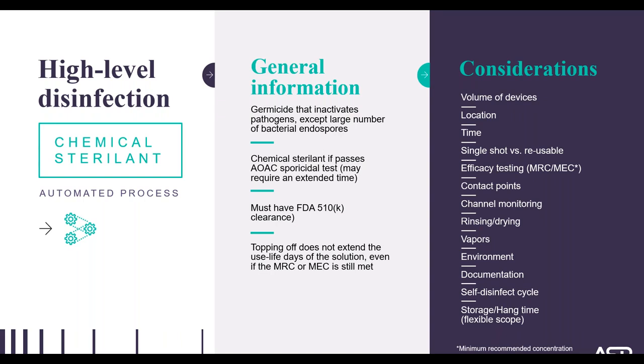Does the system allow for minimum contact points, ensuring the high-level disinfectant reaches all surfaces? Are test strips needed to check the efficacy of the high-level disinfectant prior to each use? Are there quality control checks to ensure the test strips are performing correctly? Is the system a closed system for vapor control, meaning that you're going to have minimal exposure of your staff to the chemical?